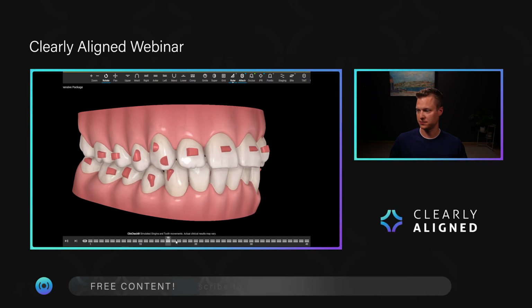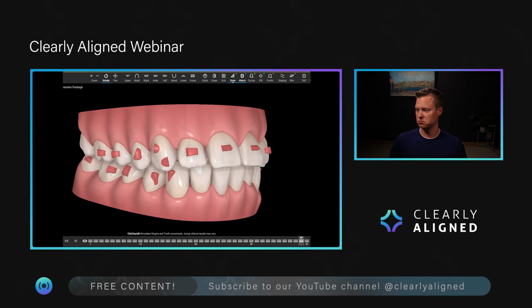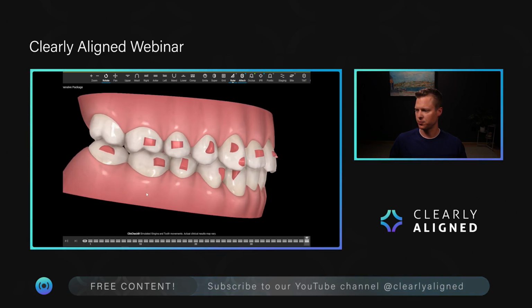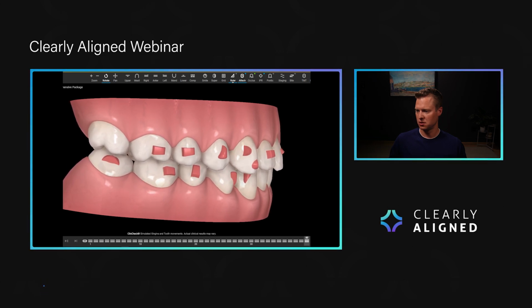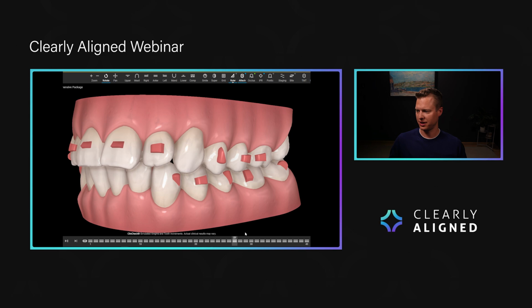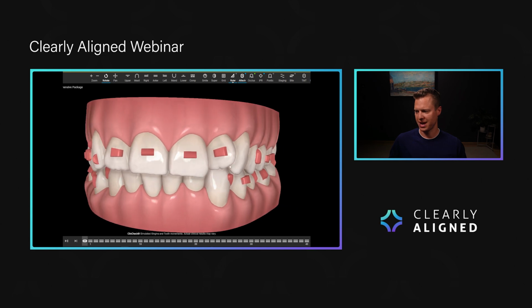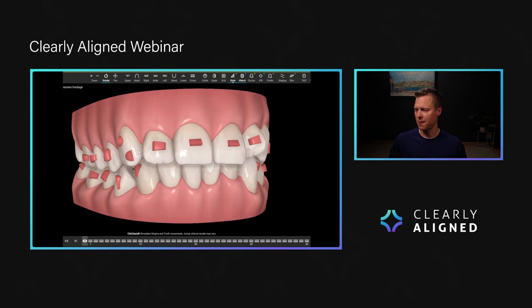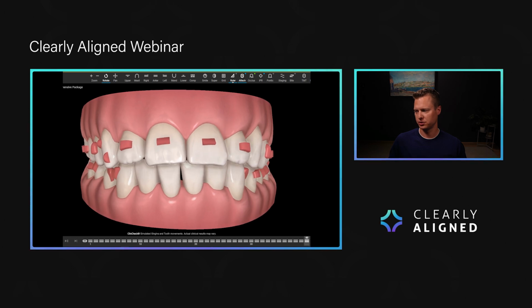So at the end of treatment, have these teeth intruded? They have. The premolars and molars are going up. Is our lateral and our canine extruding? Not a tremendous amount, mostly just derotating. So those could come down and these teeth could come up. And we may want to consider doing more intrusion than what's shown.